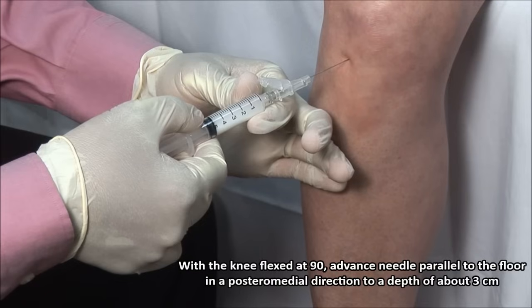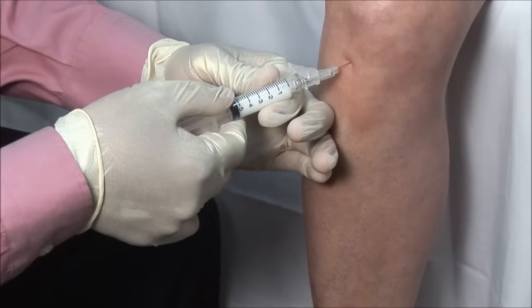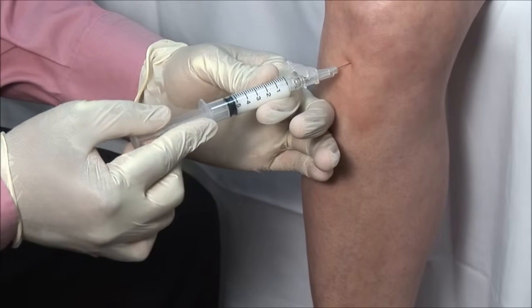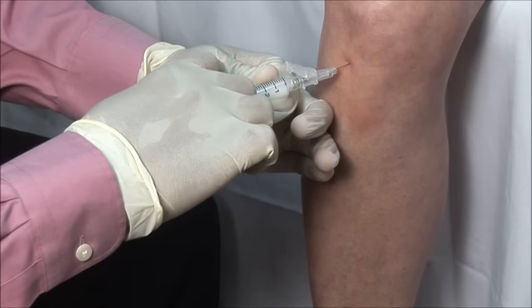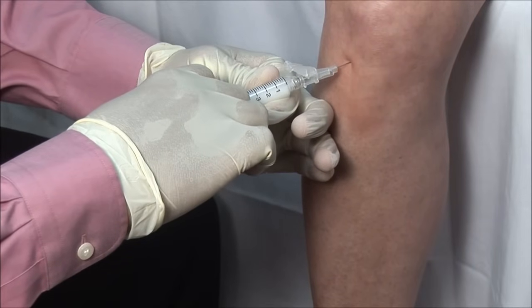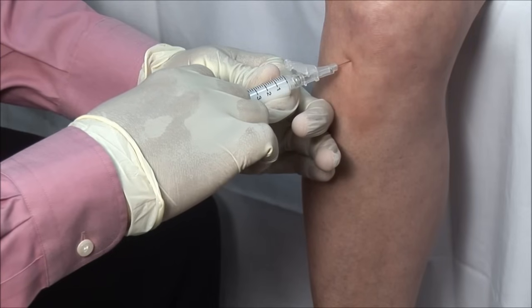If bone or cartilage is encountered, you should withdraw slightly. Always aspirate to ensure that you are not in a blood vessel. Then inject the solution. This should go in freely. If there is any resistance, then withdraw and adjust the needle to avoid injecting into tissue.